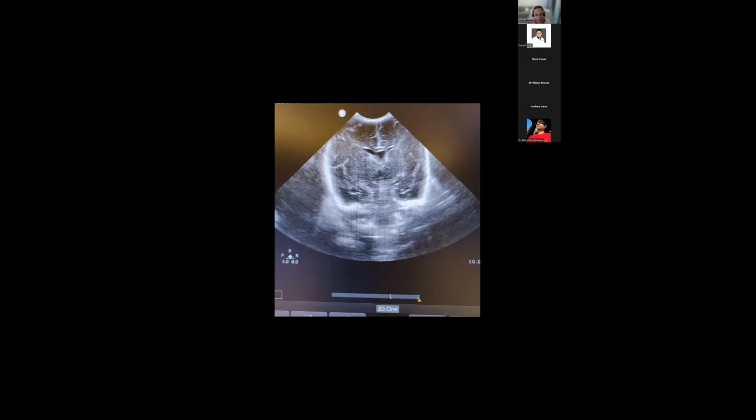Just a minute, sorry. Yeah, no problems. No, sorry, because it is like images. Okay, this one you can see. Yep, that's fine. That's fine.